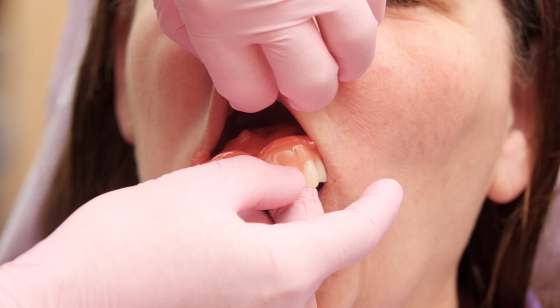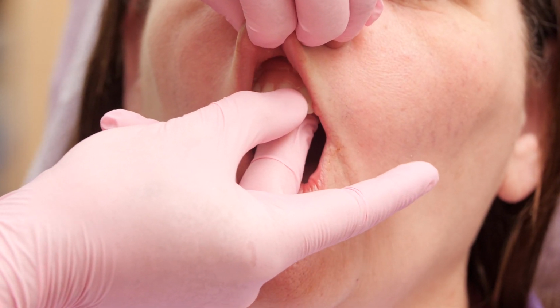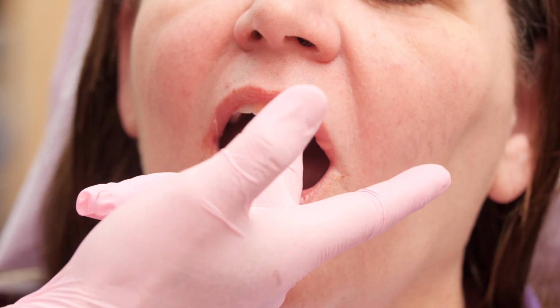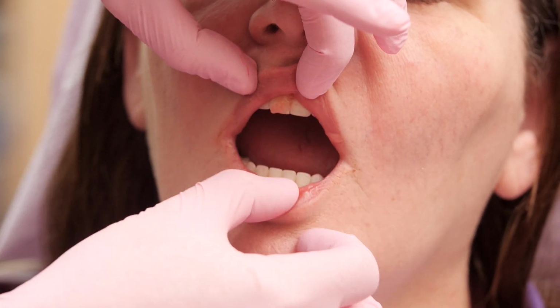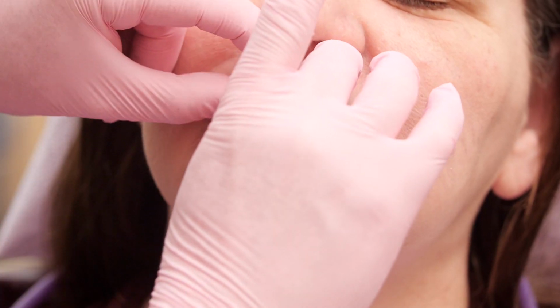Here we're placing the complete upper denture reline in the patient's mouth. It's important to seat it from the soft palate up toward the anterior. That way the material isn't expressed outward through the back of the denture, but rather through the front, avoiding the patient having unnecessary material going down their throat or causing them to choke.